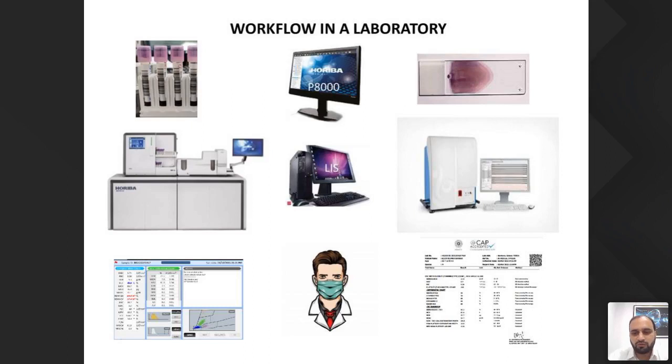Everything goes into P8000, that is the middleware of Horiba. It decides what slides are to be made, by the criteria that I have fed in. Everything comes to my personal computer, to my LIS, all the values from the analyzer, all the flags, all the graphs, and the entire report from the digital morphology platform, that is CellaVision, comes through P8000 to my LIS. I sit at my desk, I review everything, and then I release a report which I am confident enough that I am not making any mistake.